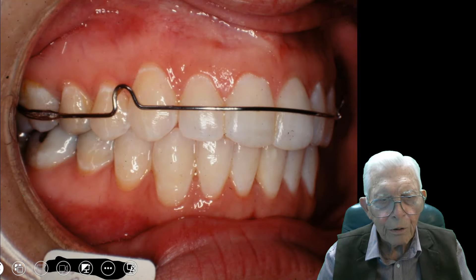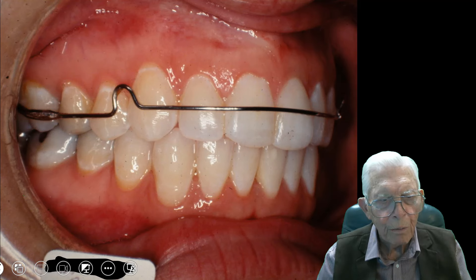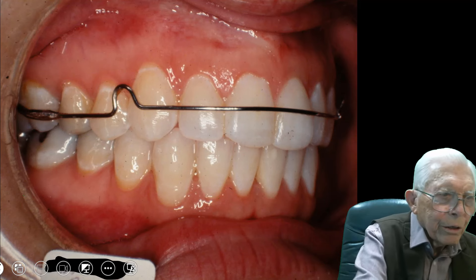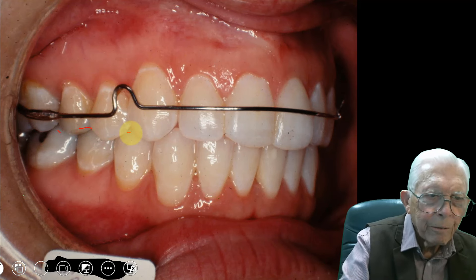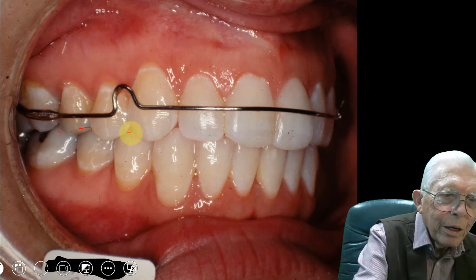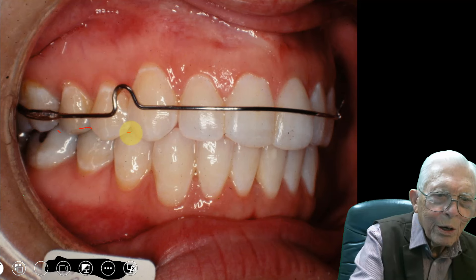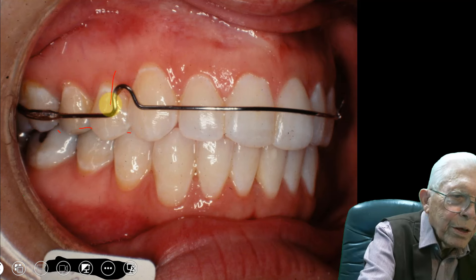Here's a case — this is the finished result. We finished it up and put a wraparound retainer. There's nothing that crosses over the teeth. I never have anything go over the teeth because you'll bite on that wire, and it'll move the teeth one way — then you take it out and they'll go the other way. You let the teeth erupt into the mouth.